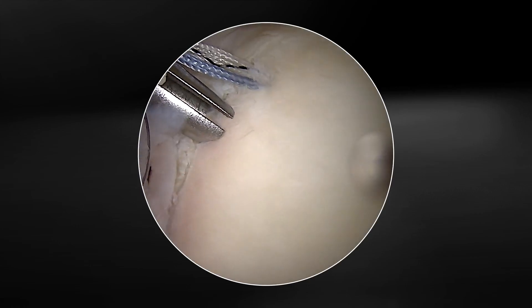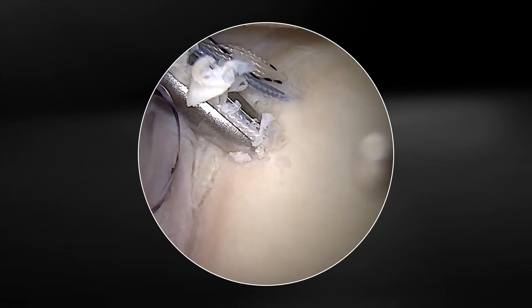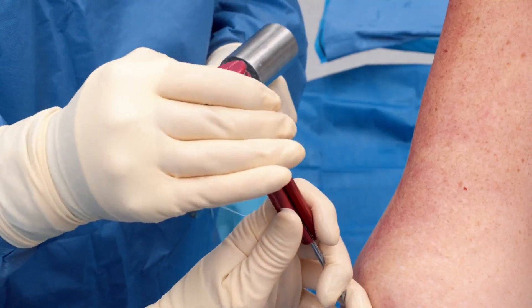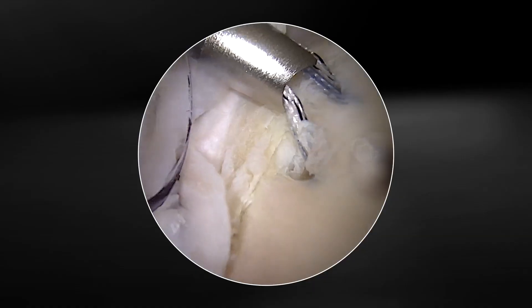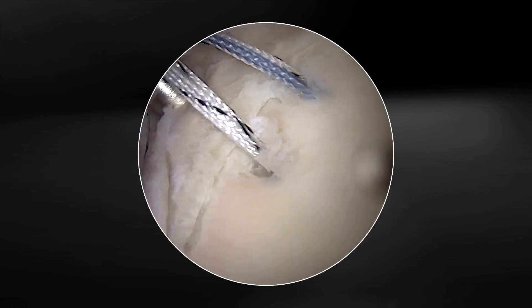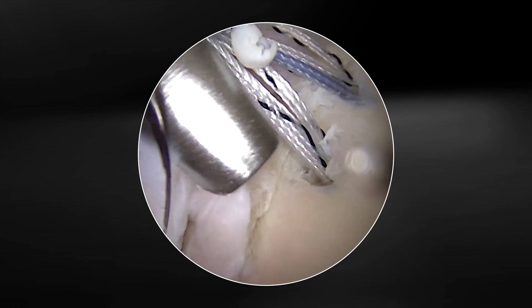We placed an anchor at the inferior position. Now we will move up to the next position without removing the guide and insert another anchor. Resist the urge to remove the guide and disengage the sutures. We'll repeat the anchor insertion and suture management steps.